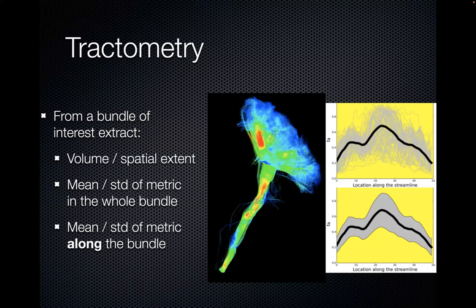And that's becoming very powerful because imagine a nice multimodality acquisition like we can do here at McGill or Concordia and Sherbrooke, where you have a myelin contrast, you have diffusion, you have fMRI, you have FLAIR, you have QSM, and suddenly you can create a fingerprint like that for all your modalities and start building this into a classifier or whatnot, depending on your research question.